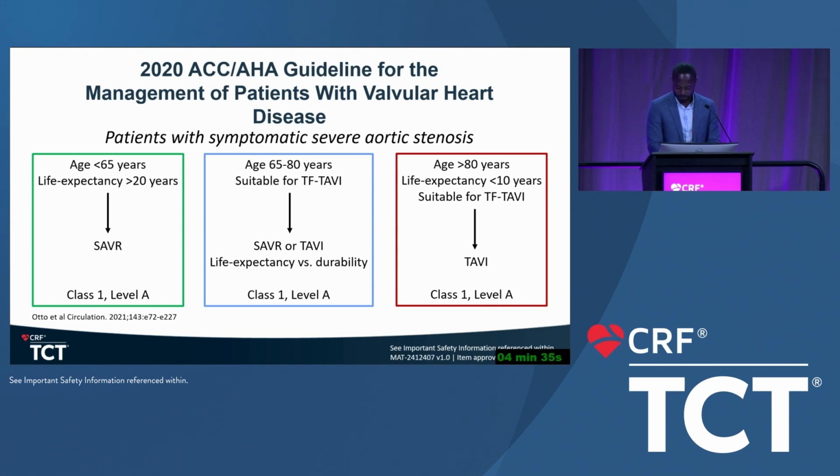And what we have with this valve, and I like this valve for this reason, is it's intraannular. We have not had a problem coming into a TAV in TAV in this type of situation because it's an intraannular valve that has good gradients. And so it's kind of the best of both worlds, in my opinion.